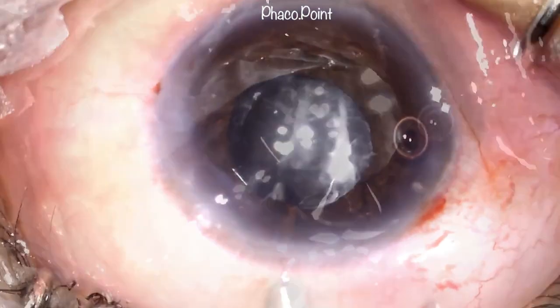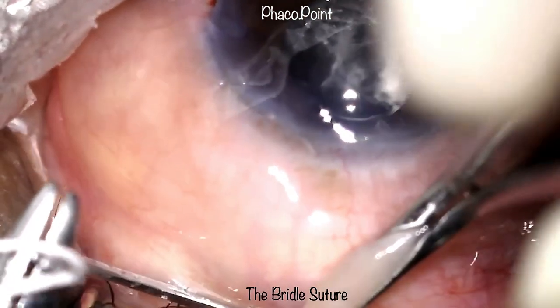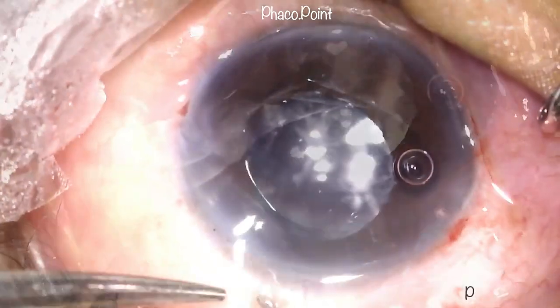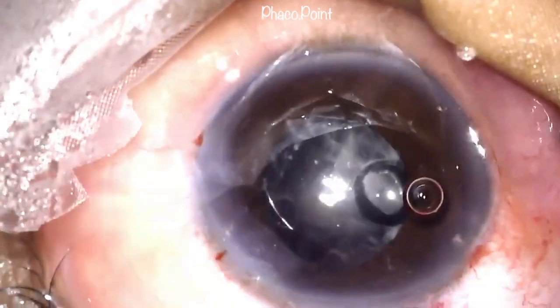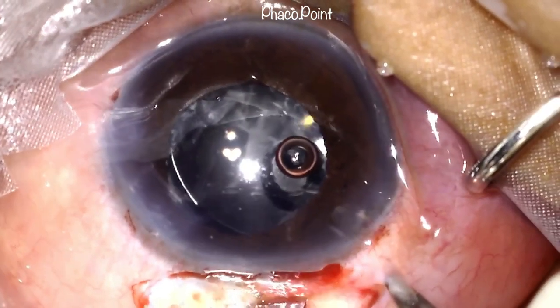The plan is to create a small scleral tunnel, almost 4 mm in size, through which the IOL will be held and removed, and a new three-piece monofocal IOL will be implanted and placed securely within the ciliary sulcus. This is what you'll see in this part of the procedure.